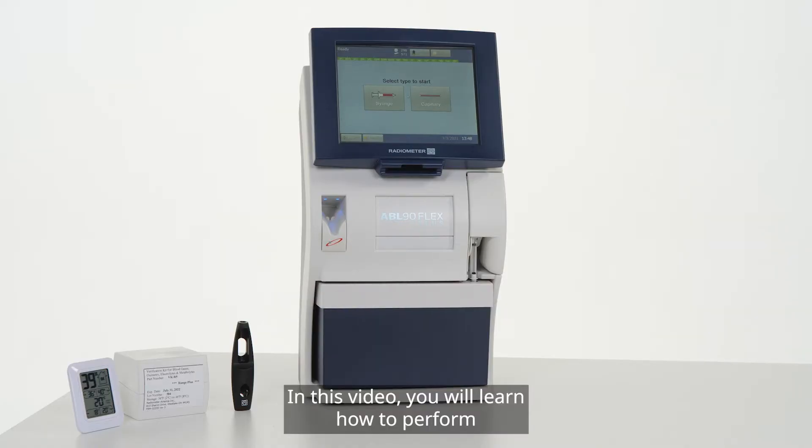In this video, you will learn how to perform linearity studies on the ABL-90 Flex Plus Analyzer.